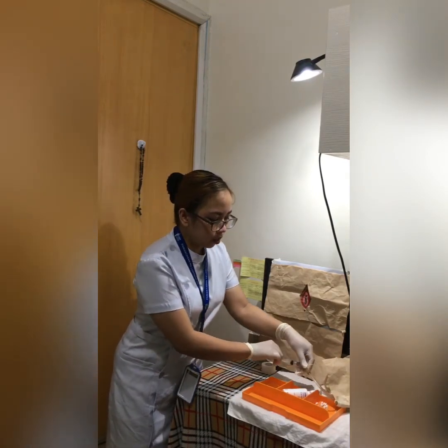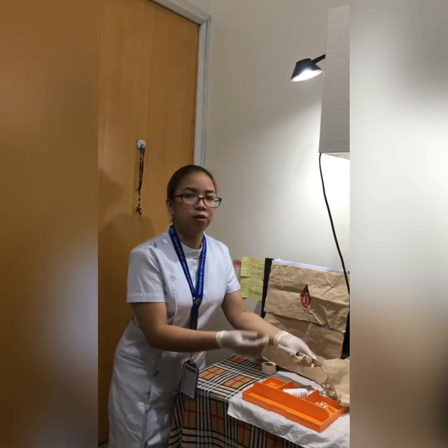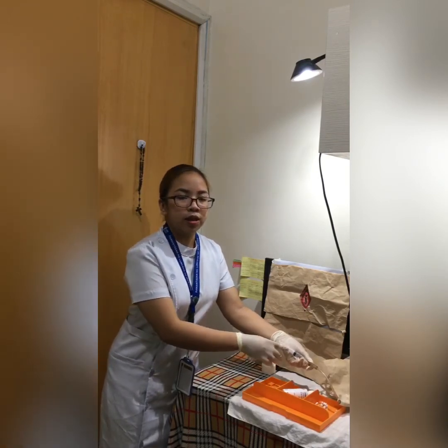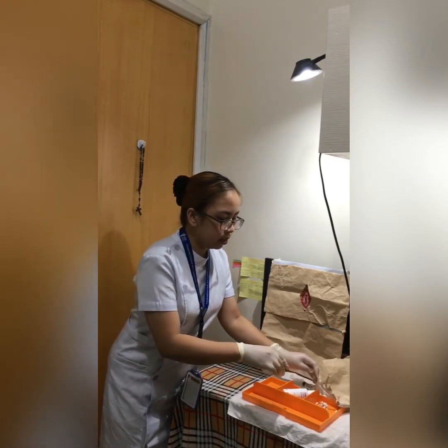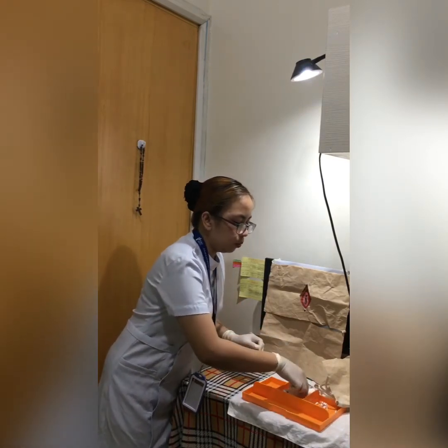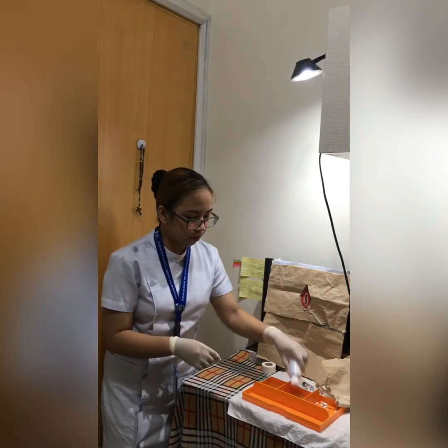Assuming that we already checked that the balloon is working normally, next we're going to put betadine on this area.